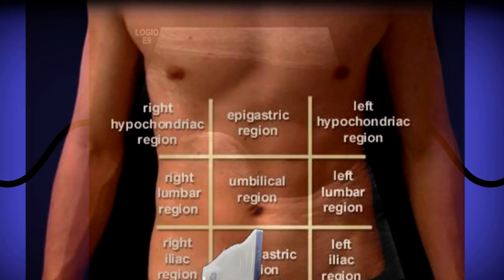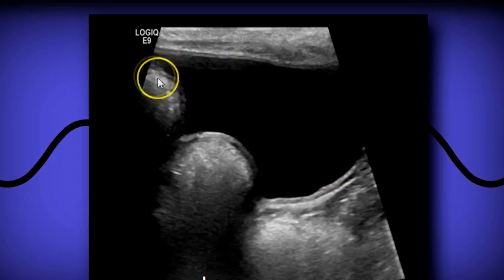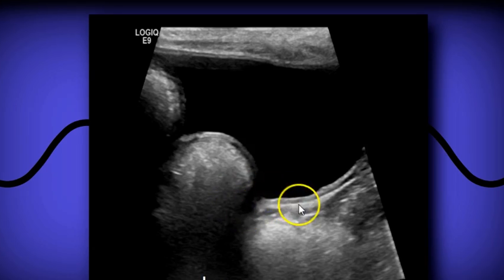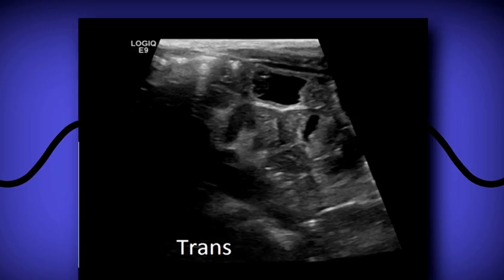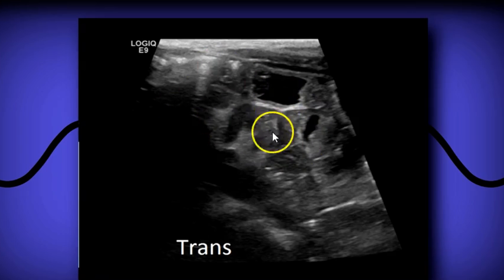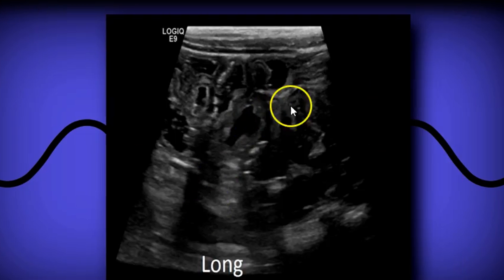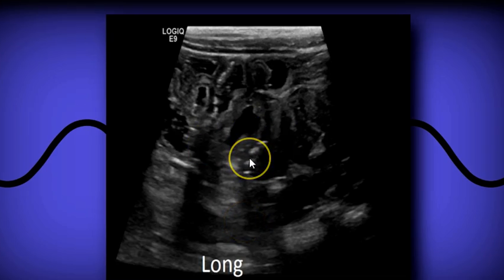In sagittal it's the same — bladder longitudinally — and here you can see the colon filled with air and feces. Moving along to the left lower quadrant, in transverse you're going to find the psoas muscle, and on some patients you will also find small bowel and descending colon. Sometimes you'll have fluid-filled small bowel loops, and the descending colon may be fluid-filled if the patient has diarrhea.